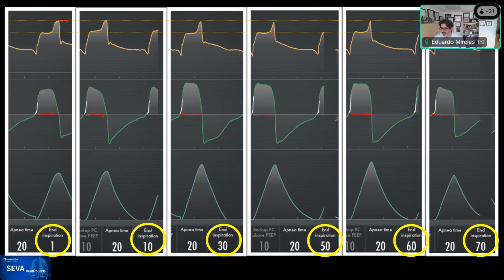We always define on pressure support that we cannot have intentional inspiratory pauses. But according to what we are seeing, we can have an inspiratory pause caused by Pmus relaxation. Well, there's not a pause, but what you would expect is that if this was a perfect controller, this would end up right here, or closer to it. So there's not a pause per se, it's just the muscles relaxing rapidly. The shorter I make it, the less I see it; I'm doing this intentionally to get rid of it. But it's a relaxation of the muscles. The effort has stopped.